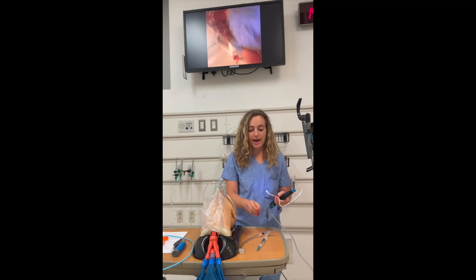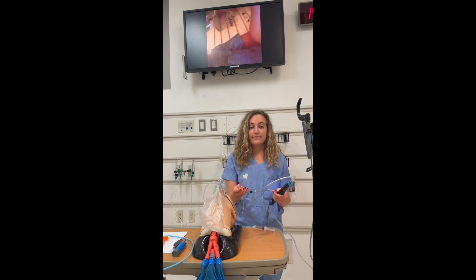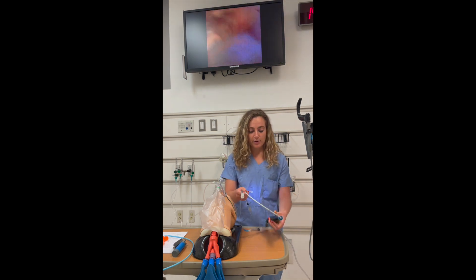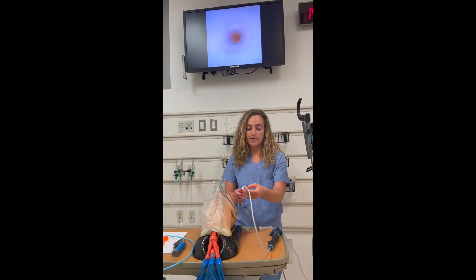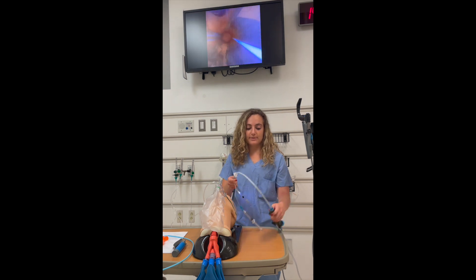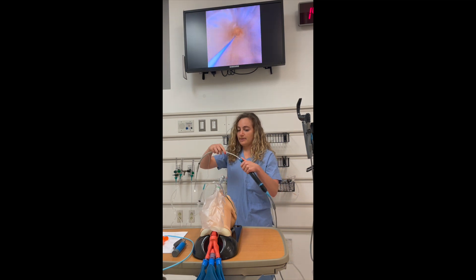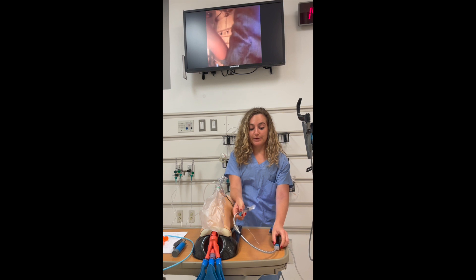You want to have your ET tube ready as well. It's important to note that you need an ET tube that's at least 0.5 larger than the size of your fiber optic, so you want at least a 6.0 tube. You'll pre-load the ET tube onto the fiber optic before you get started. For this device, you do not need to take off the plastic adapter beforehand — you can go ahead and get that set up with your syringe.